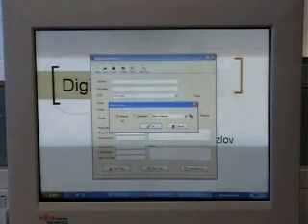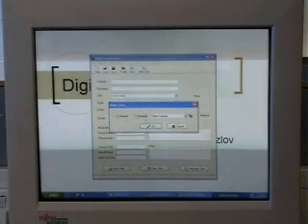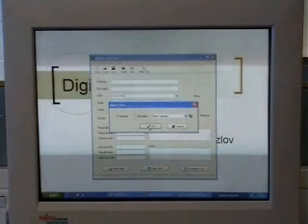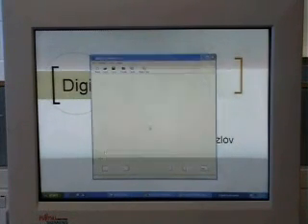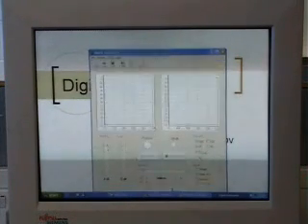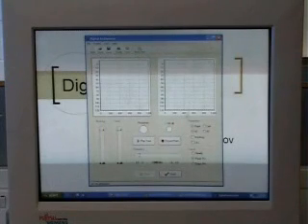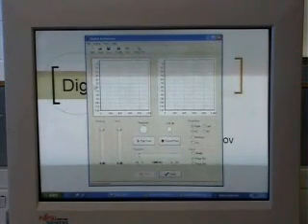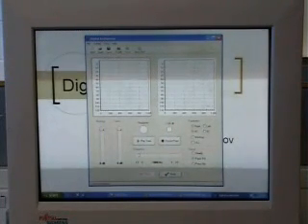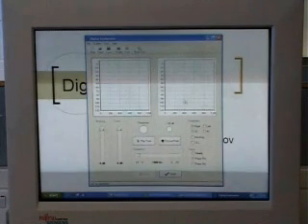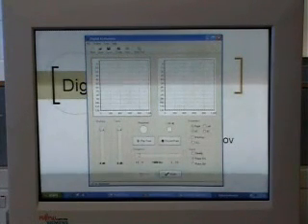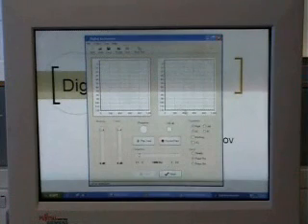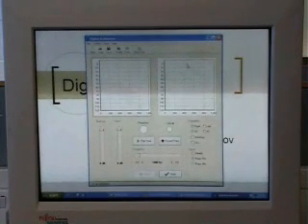The test can be conducted in manual mode or automatic mode which is a brand new feature. So we start with the manual test just to show the graphical user interface. Now here we're going to see an audiogram for the right ear and an audiogram for the left ear. That's where we're going to plant the actual points and draw an audiogram for the person.